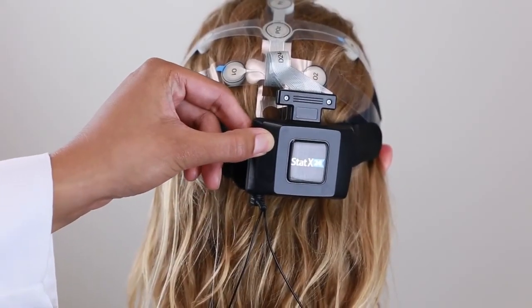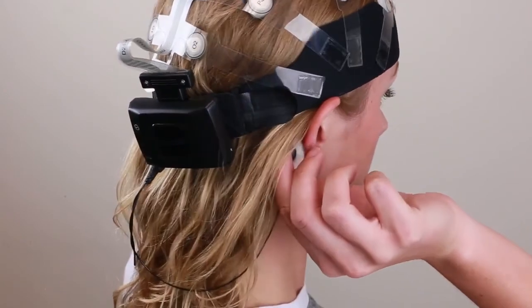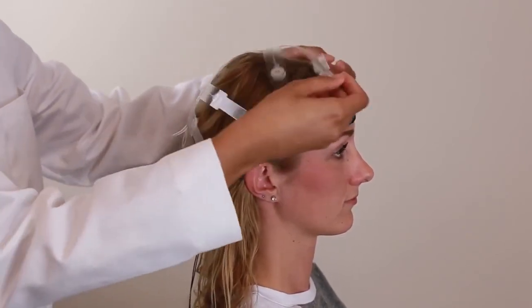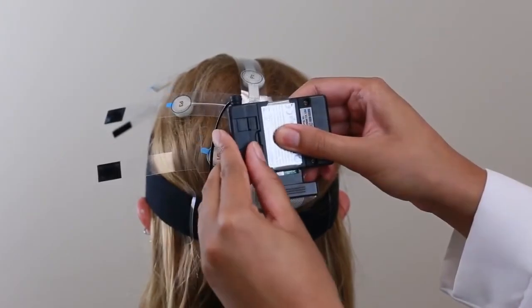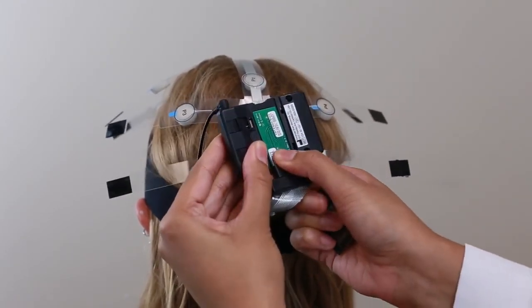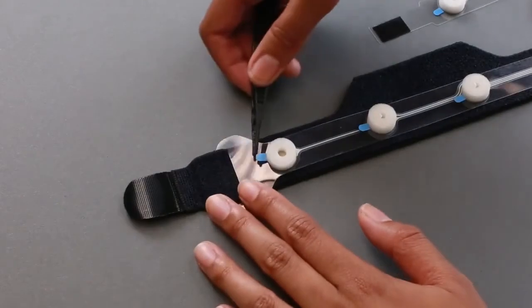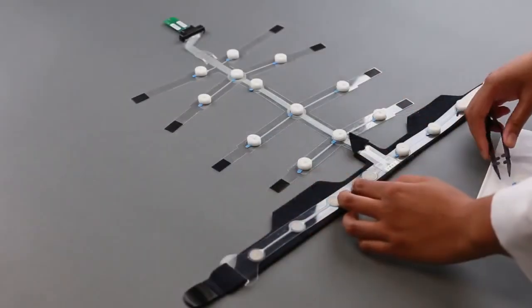When acquisition testing is complete, turn the device off. Carefully remove the adhesive sensors from the ECG clavicle sites and linked mastoid sites, or ask the participants to do so themselves for personal comfort. Detach all the strip arm tabs from the neoprene strap, starting from the back and working to the front. Unfasten the Velcro tabs that attach the device to the neoprene head strap. Flip the device upside down, take the Velcro strap from the plastic loop, unlatch the door on the device and remove. Disconnect the device from the connector carefully so that you do not damage either part. Unfasten the Velcro and lift the strip away from the participant. Lay the strip down on a flat surface. Using the plastic tweezers provided, remove all foam sensors by peeling rather than pulling to ensure no adhesive remains. The quality of the strip will be reduced if adhesive accumulates over time.